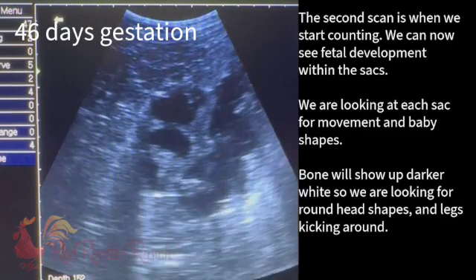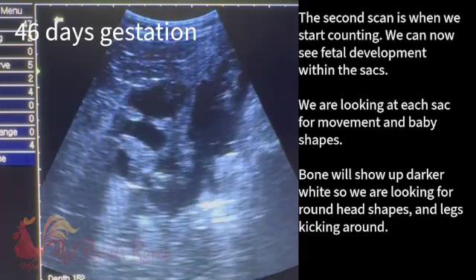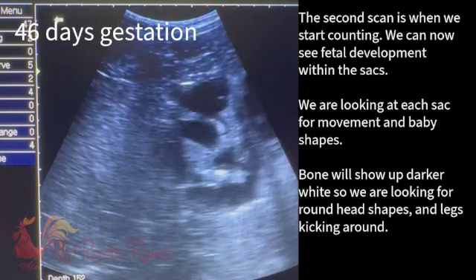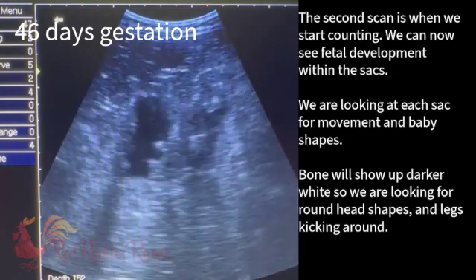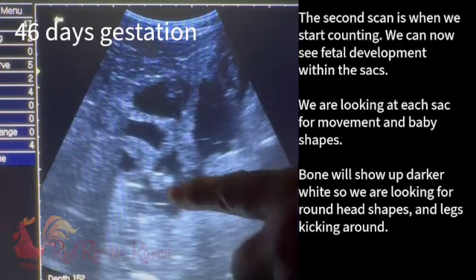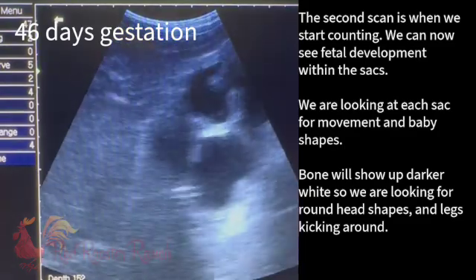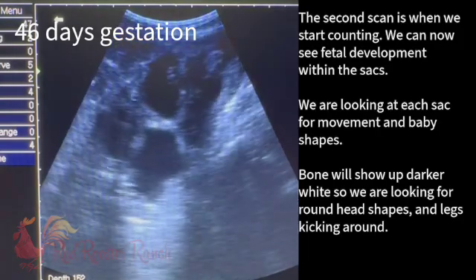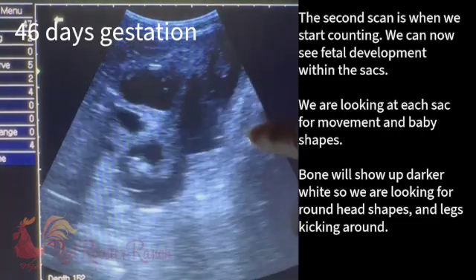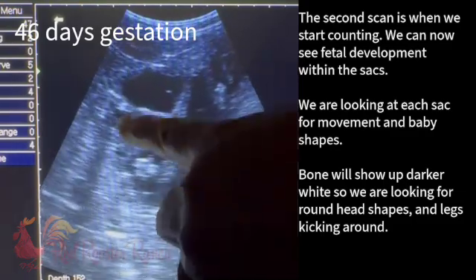That looks like it should be a baby, but having a hard time getting it in focus. Let's see if it moves. That looks to be like a skull. Why we like the 45 days is their bones are starting to be solid enough. Right there and there — look at that. That looks like a head, and I definitely think I saw a head there.